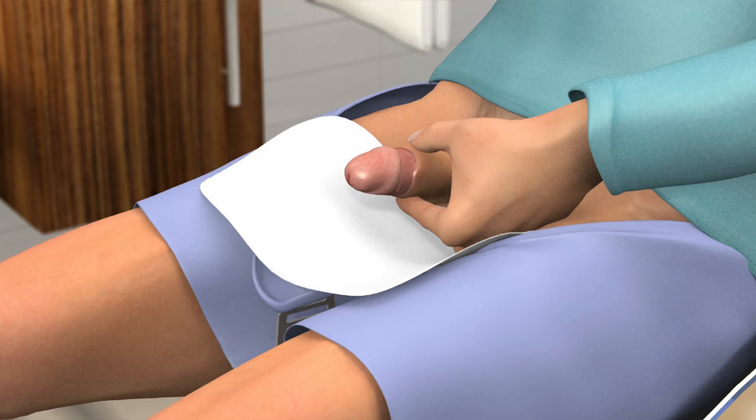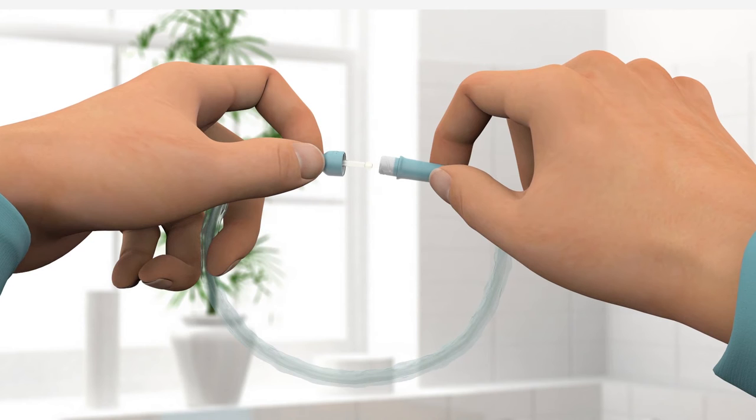Take the catheter out of the packaging and twist the lock to open. Make sure to hold both ends of the catheter upwards to avoid spillage of the liquid inside the sleeve that covers the catheter.